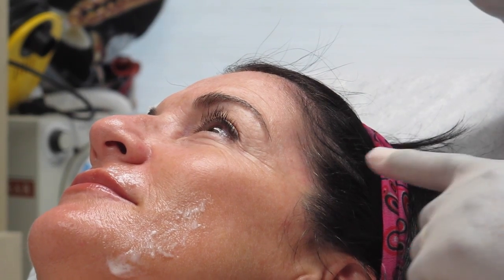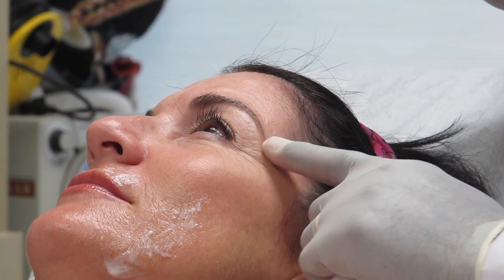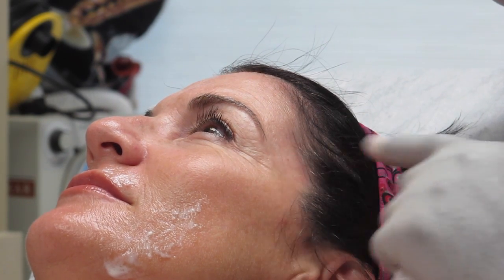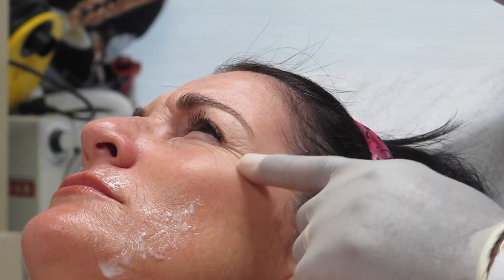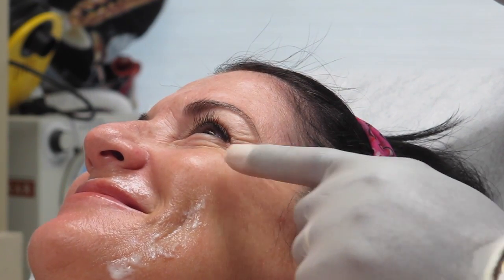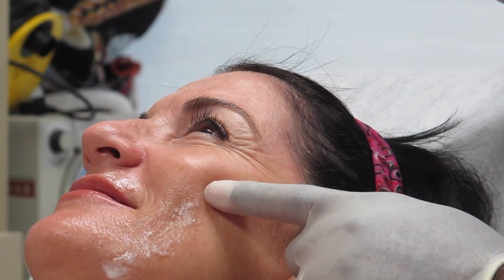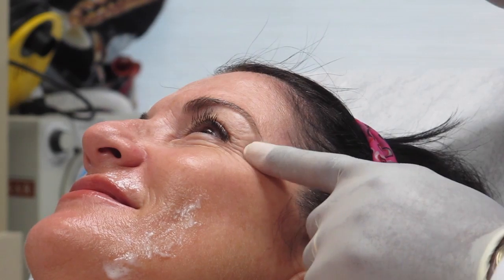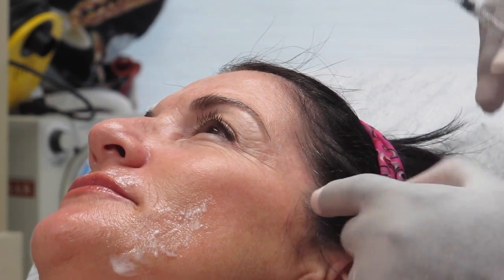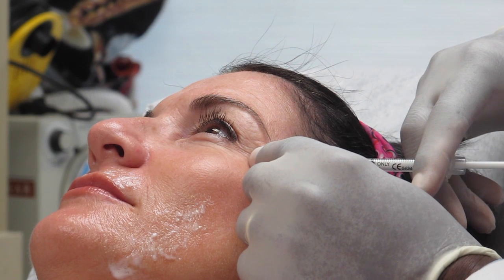Okay. Now we're going to do the crow's feet, or lateral canthus, on the left side. Have you frown for me? Good. Or squint real hard? Yeah, so then we see that, and smile for me. Yeah, and see how it really accentuates lines. The one thing about it is when you smile, you push up something from the cheek. You can't eradicate that. But the lines, if you squint real hard, that's what makes it better. You can relax it. And same thing, I put a nice little fan pattern around the eyes.